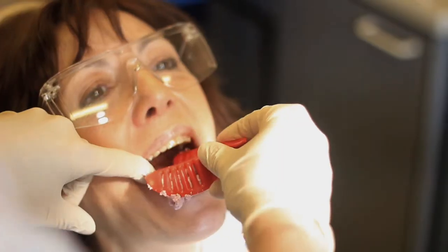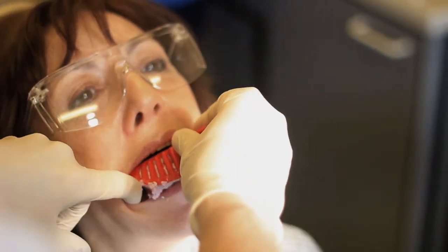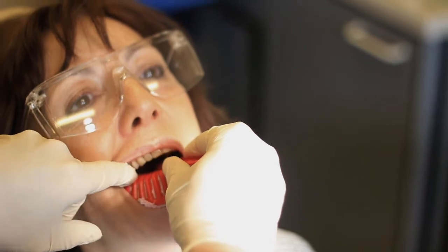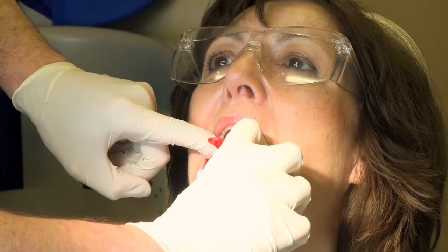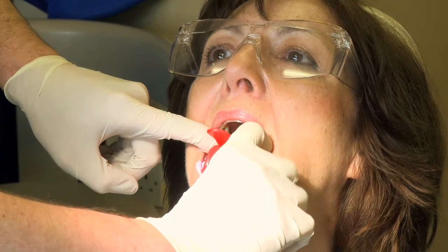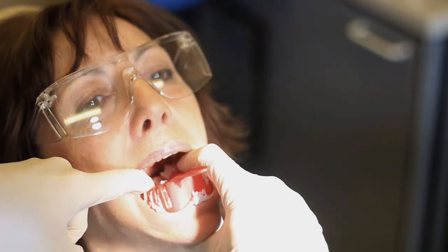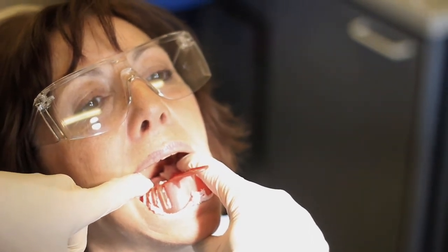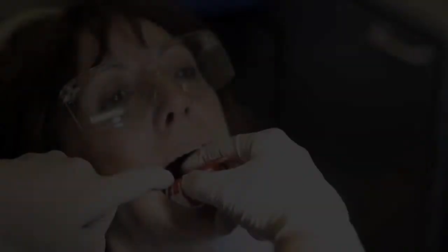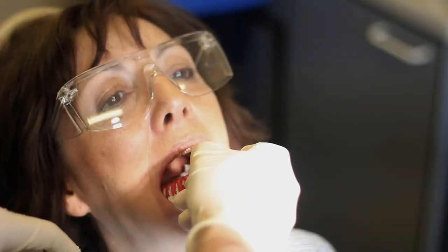Impression in your mouth, okay? I'm just going to gently press it over your teeth, and once we've put the impression in, we're going to leave it for 2 or 3 minutes to let it set now, okay? Hopefully that should be fully set now, so we'll take it back out.